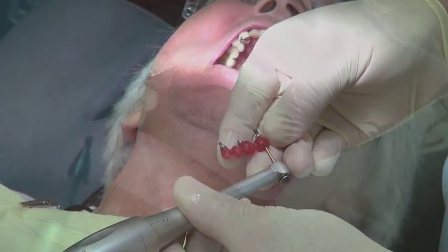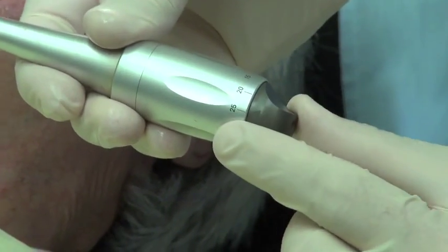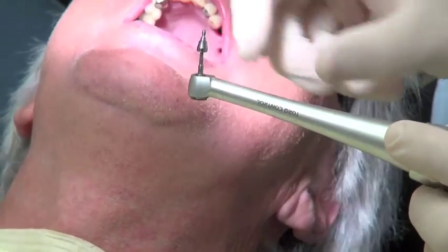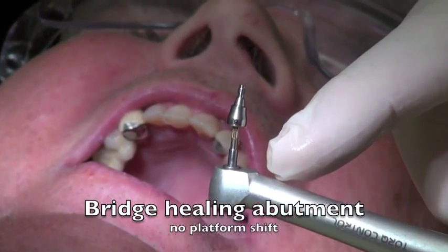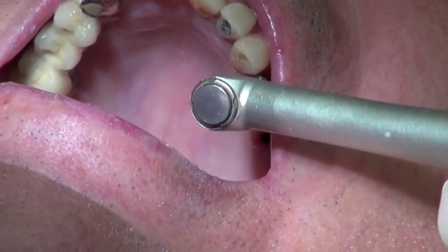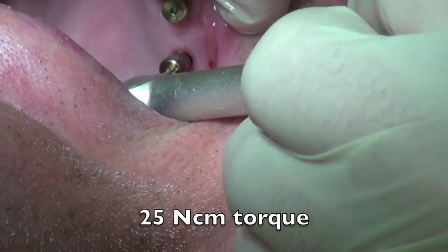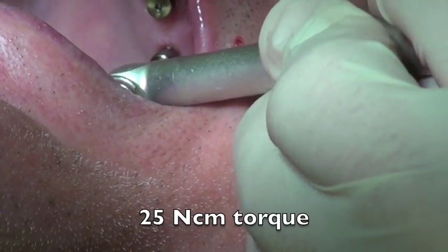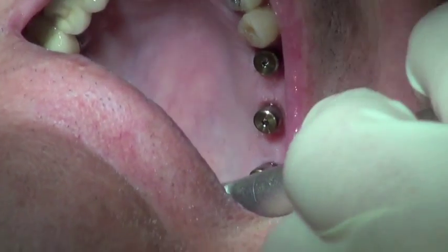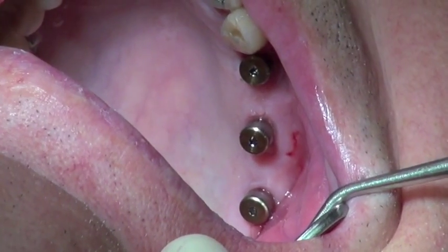We take the device out of the mouth and we're going to place our bridge healing abutments back on, knowing that we've changed them to now have a non-platform-shifted situation. I'll take the torque control wrench, set the torque, and put this non-platform-shifted healing abutment in — you can see it goes to the outside of the implant. It's important to note that I used platform-shifted first, then went to non-platform-shifted intentionally to allow healing before reaching this level. The bone responds quite favorably when this approach is used. We'll let this sit while we make the bridge.